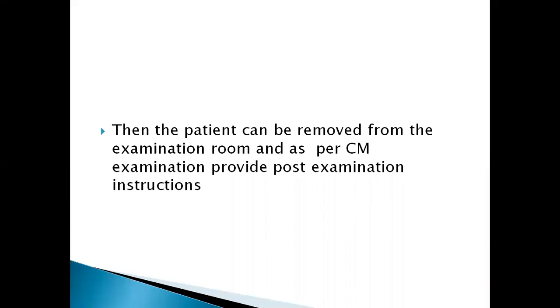If you are satisfied with everything, now the patient can be removed from the table, and you give your post-examination instructions. Remember, just like any contrast media examination, the patient should be kept for maybe 5 minutes just to observe them and see if they react to the contrast media that you've just administered.